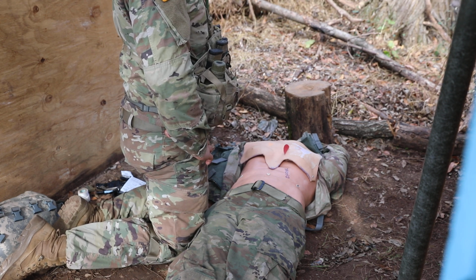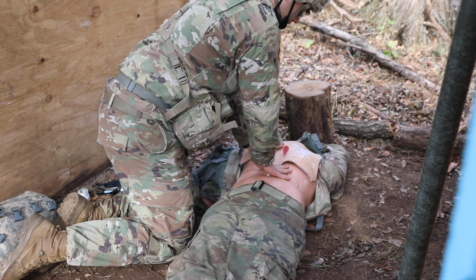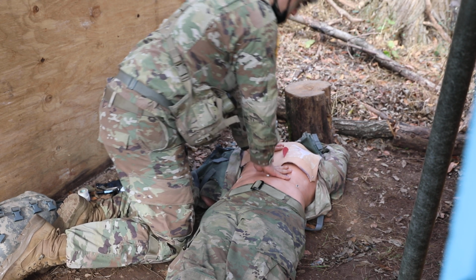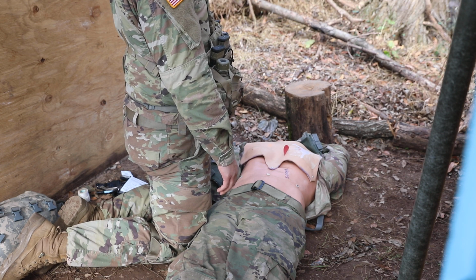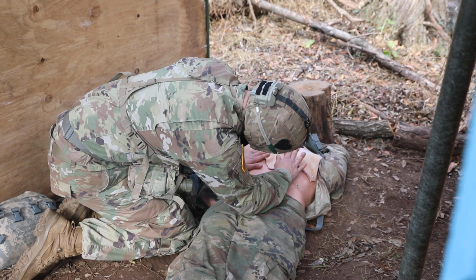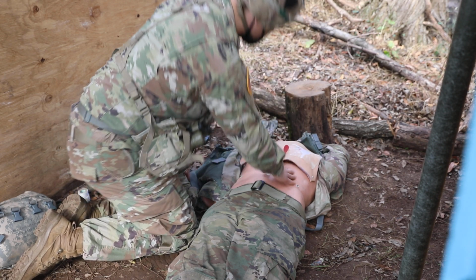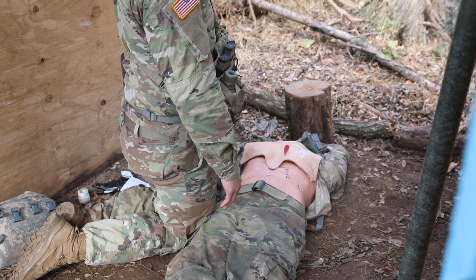Look at and feel the patient's chest for signs of air in the chest wall, subcutaneous emphysema. Checking for air in the chest wall. Grader will state you feel a crackling sensation on the casualty's chest. Check for unilateral distension and chest expansion. Looking for even rise and fall. Grader will state the hand on the unaffected side is higher than the other.